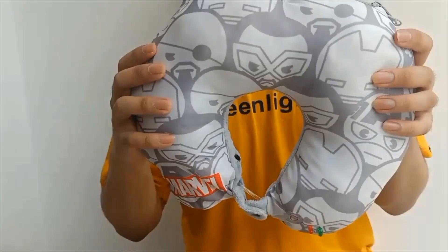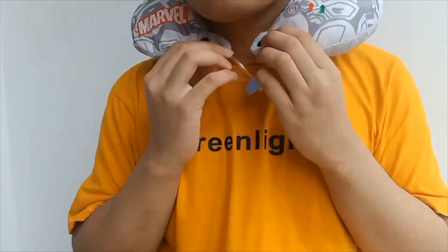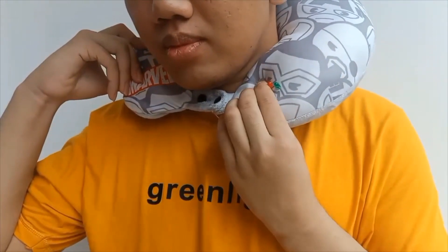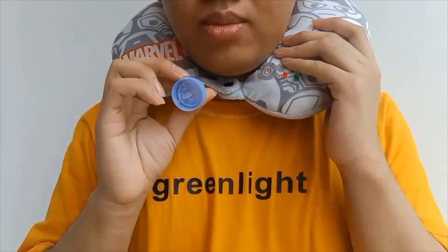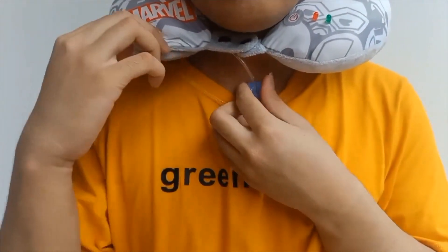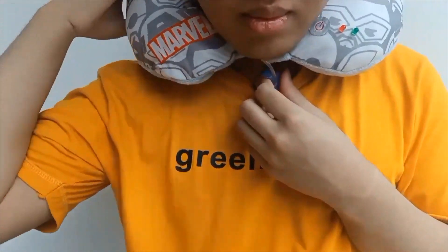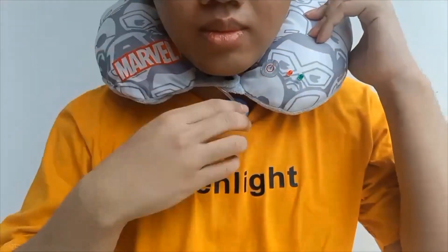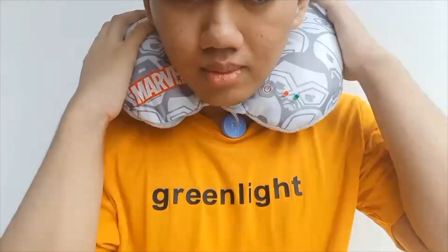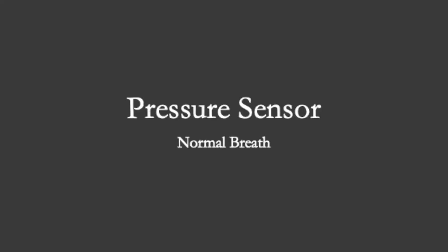There is also a button to ensure the pillow is closely attached to your neck and to make measurements more accurate. To use it, you put it on like a travel pillow, press the on button, and place the chamber on the suprasternal notch at the front of your neck. Since this is a prototype, we are still working on making the chamber more comfortable. You then leave it on for the whole night and the device will detect any sleep apnea incidents during your sleep.